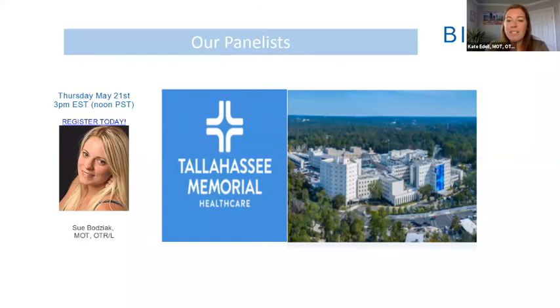So I know we've got some great questions that we've previously had submitted, and I know you have quite a few patient examples to help us with this. Before we jump into those though, can you tell us how you use the eval portion of the device to determine specific deficits demonstrated by your patients?